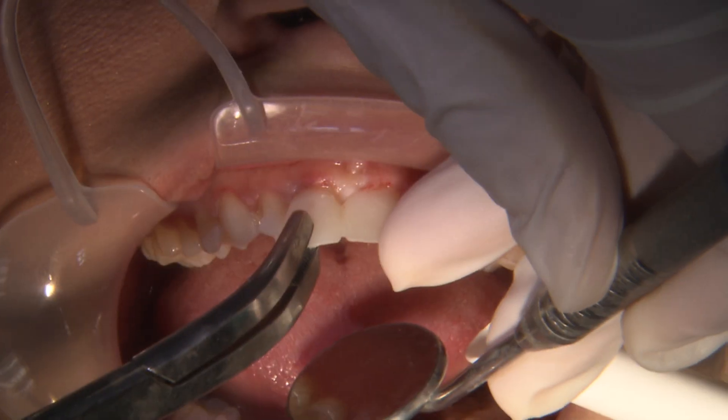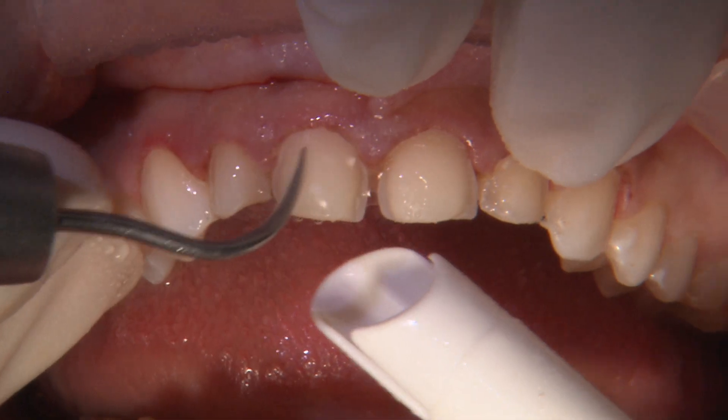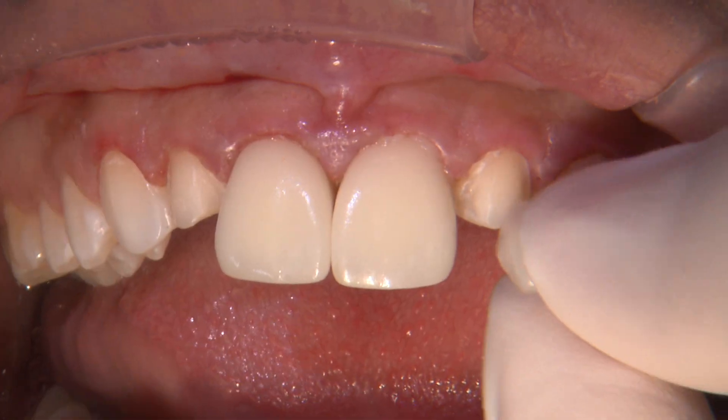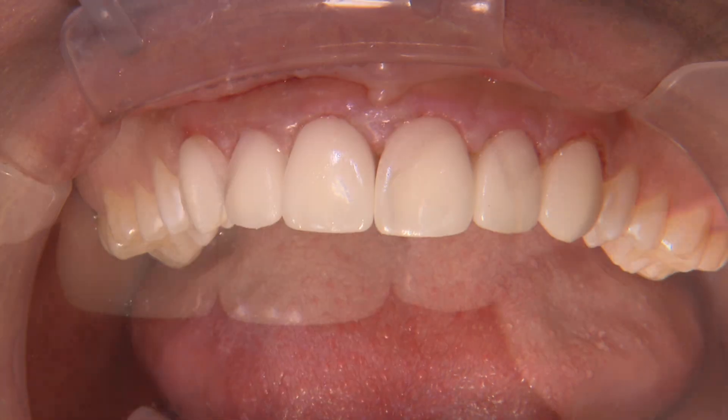I use crown removal forceps to carefully break away the temp material and then use an ultrasonic scaler to clean the preps. I try on the Obsidian CAD lithium silicate veneers with Kerr NX3 clear try-and-paste to evaluate the final aesthetics.